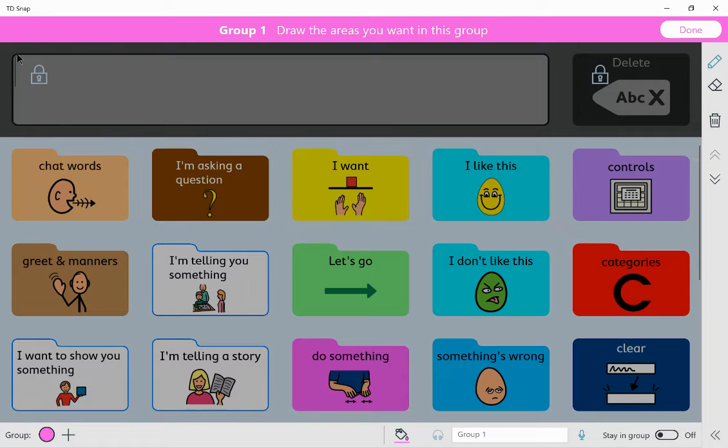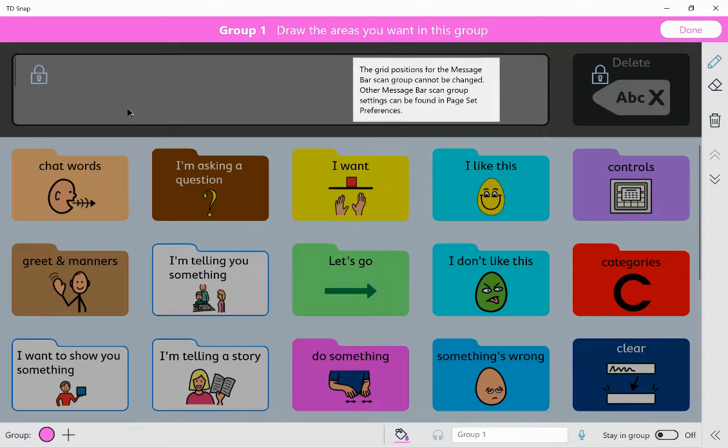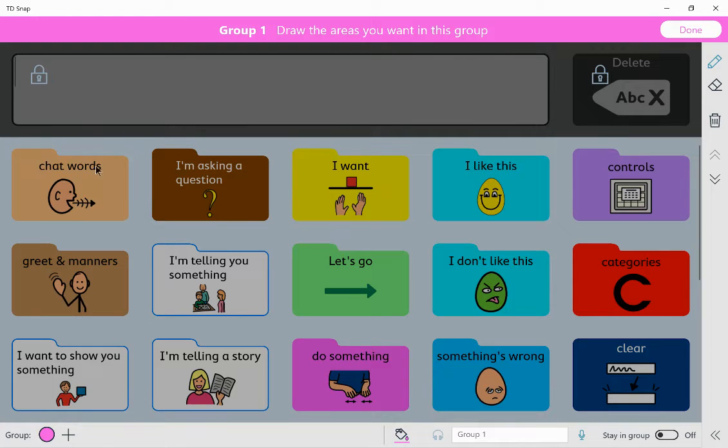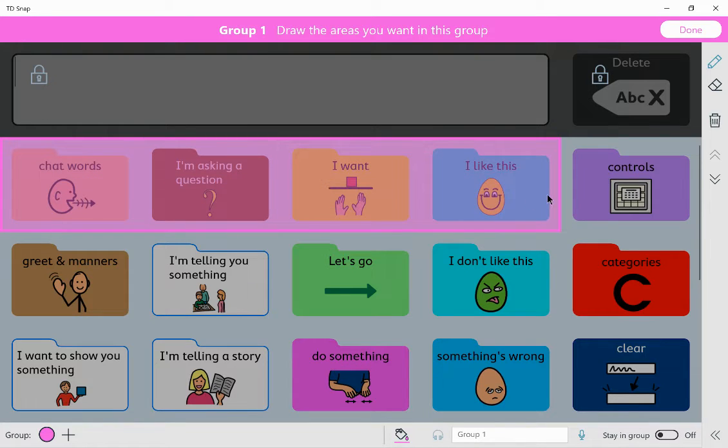So if I want to do my first row of the scan, I'm going to click group one and click on the buttons that I want in that scan.